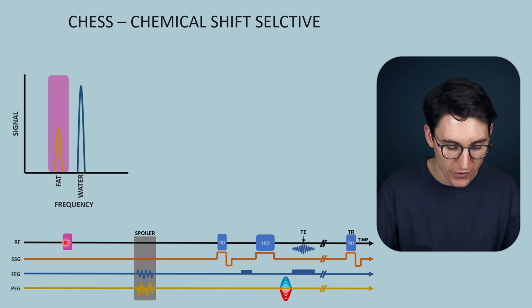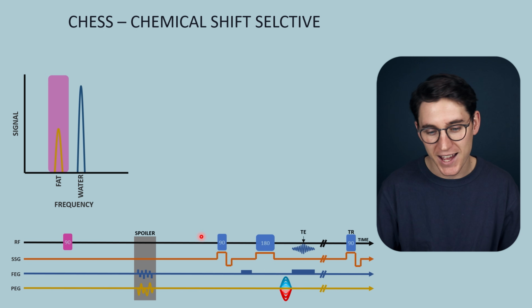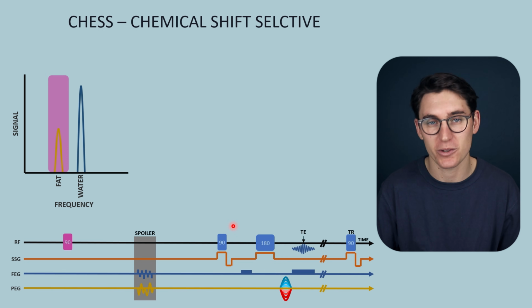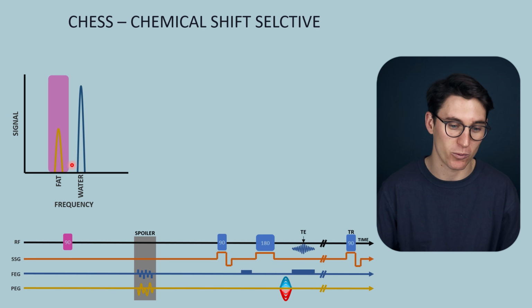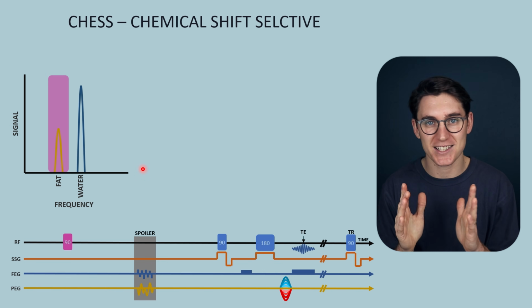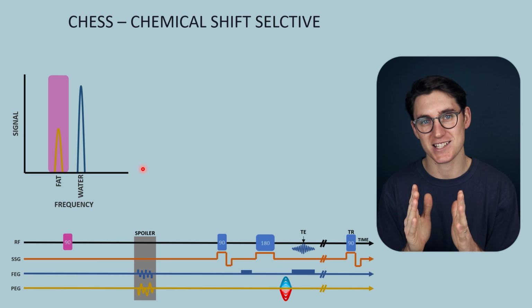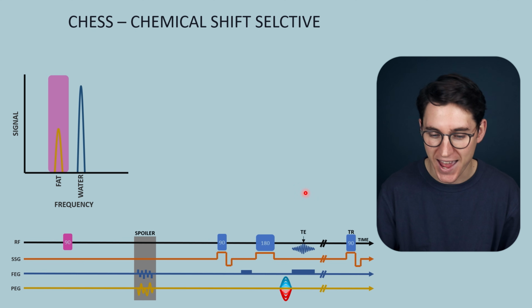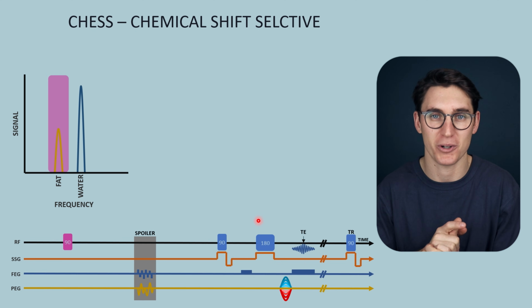Nulling fat first, preventing fat from contributing to signal within our image, allows us to run a normal pulse sequence with a wide bandwidth. It doesn't matter if we select frequencies that fat would have had, because fat is no longer contributing to signal. We can select the appropriate thickness slice and create the image as we've discussed in spin echo or gradient echo or inversion recovery pulse sequences.